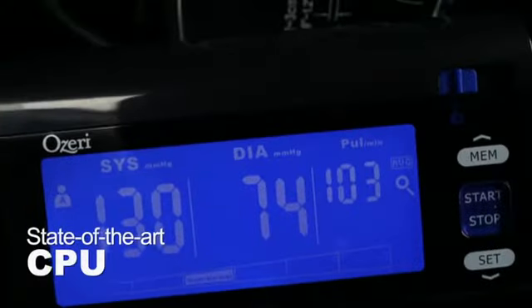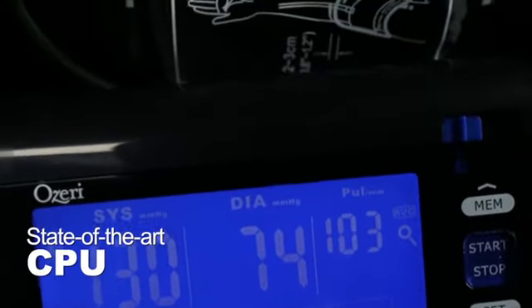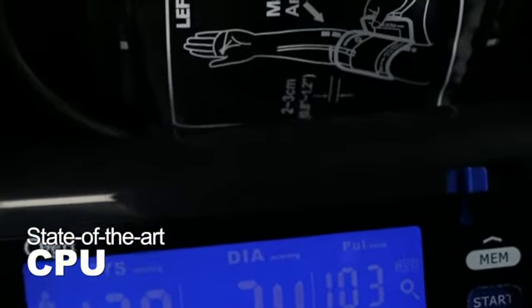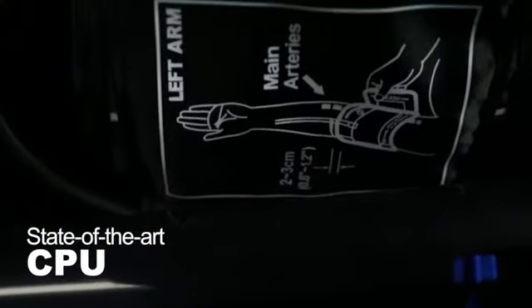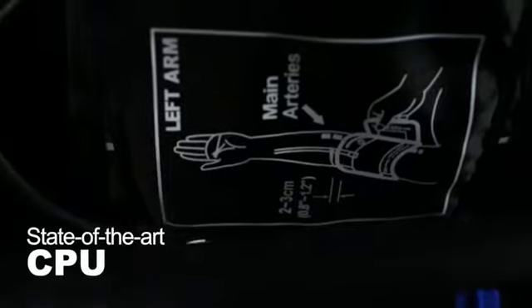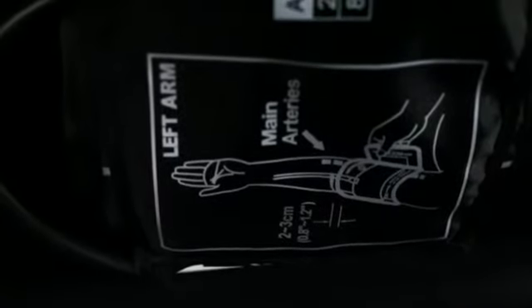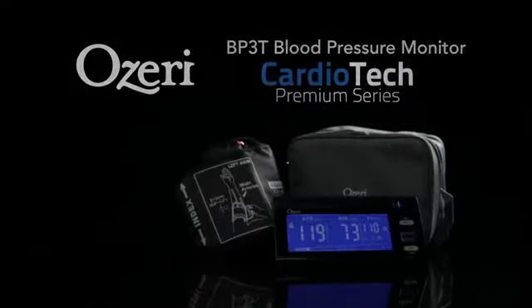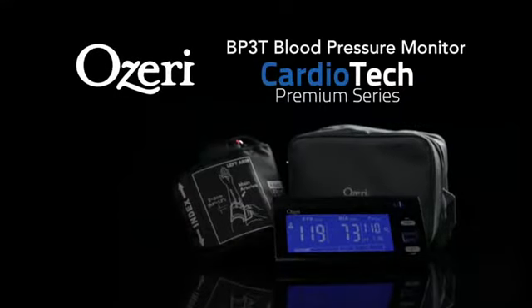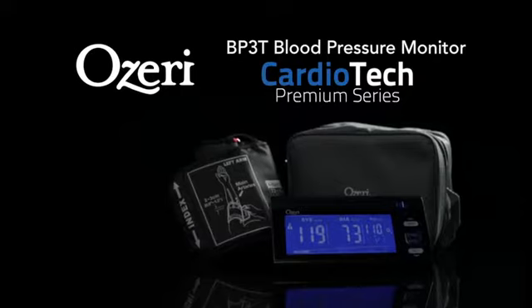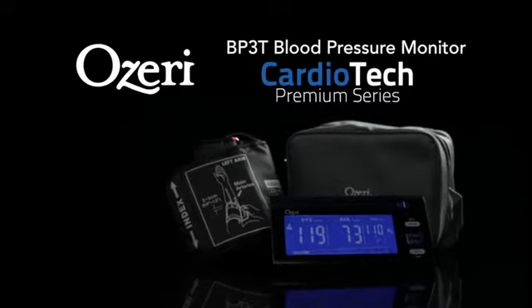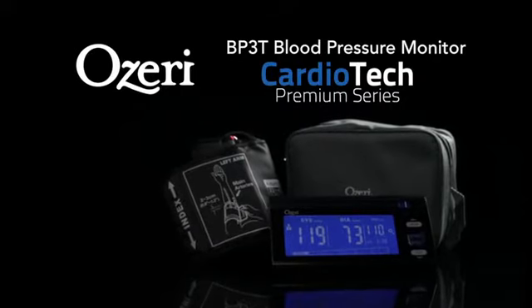And a state-of-the-art CPU that reduces measurement time and improves accuracy, all while increasing comfort. Take control of your heart health with the BP3T Upper Arm Blood Pressure Monitor by Ozeri.